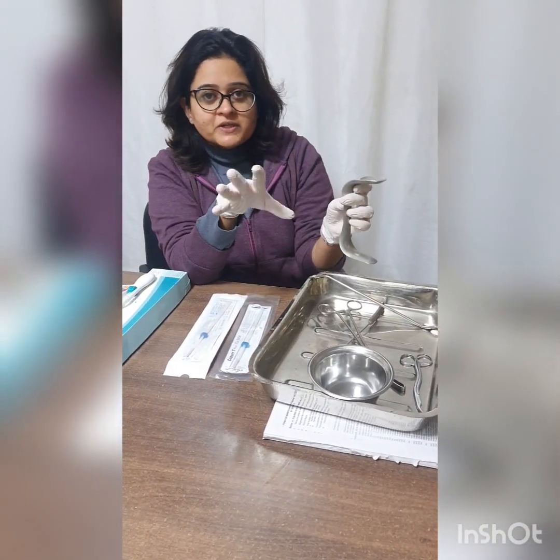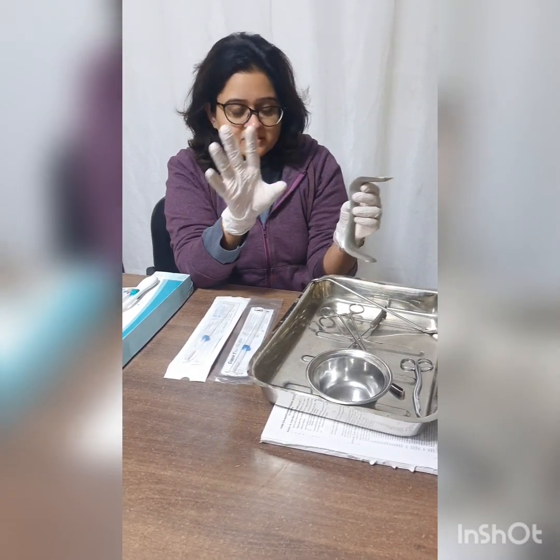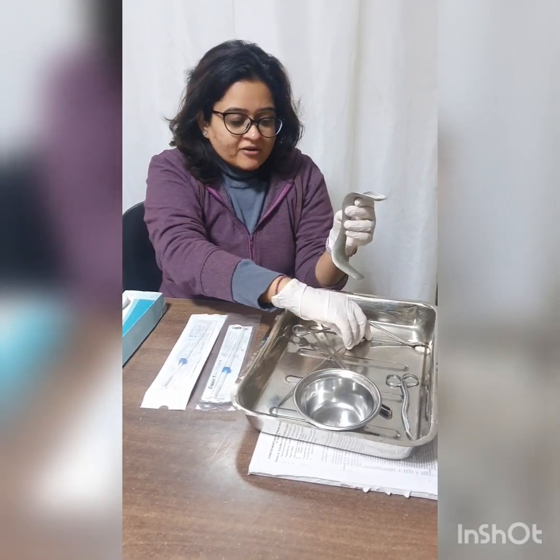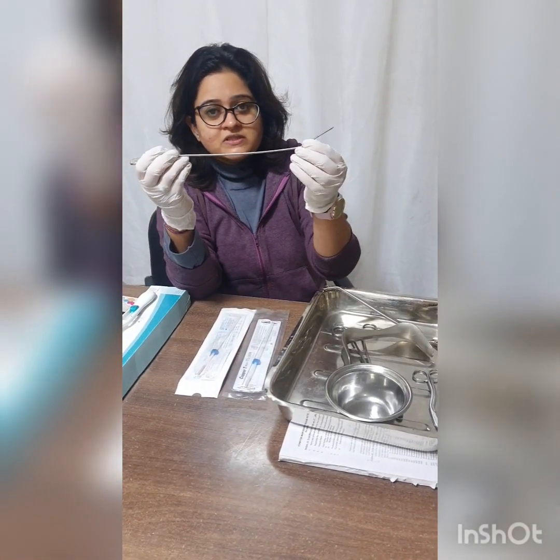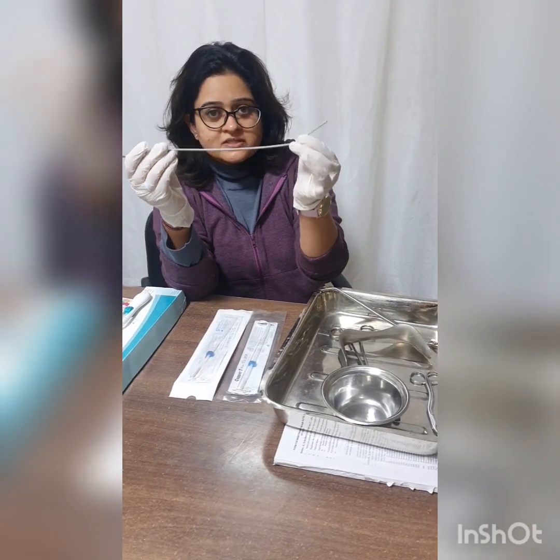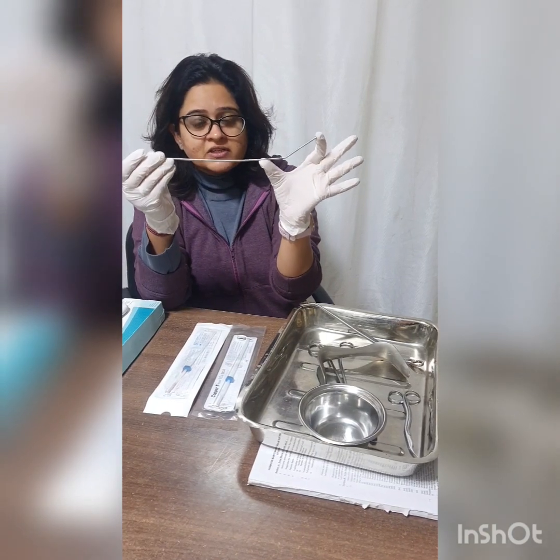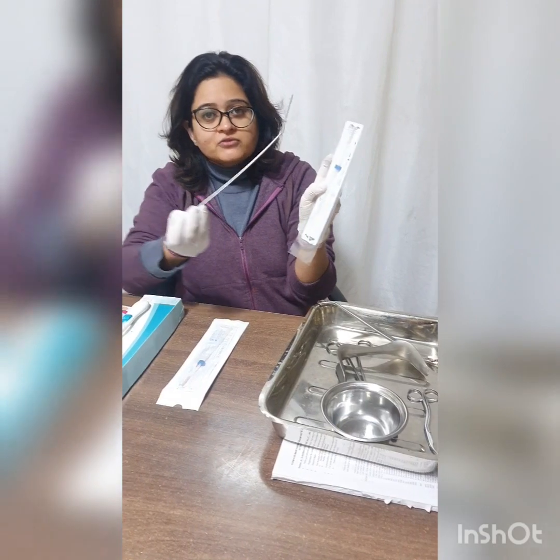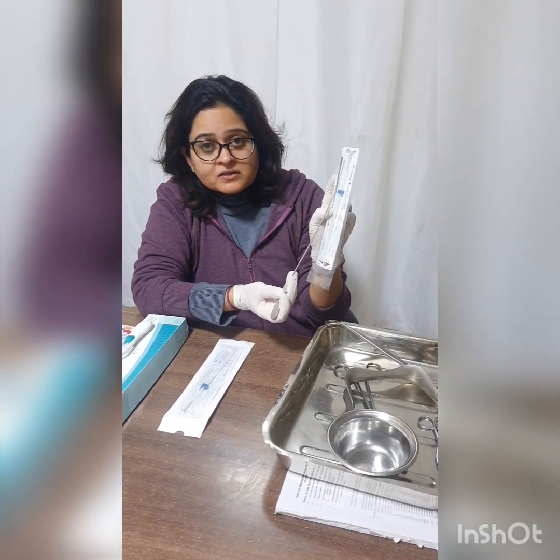Before all this, we have to paint and drape the woman and paint the cervix with an antiseptic solution. After visualizing the cervix, very importantly, we use a uterine sound to measure the length of the uterus. The uterocervical length is measured, which is very important because whatever measurement we get on the sound, we have to adjust that length on the copper T accordingly.